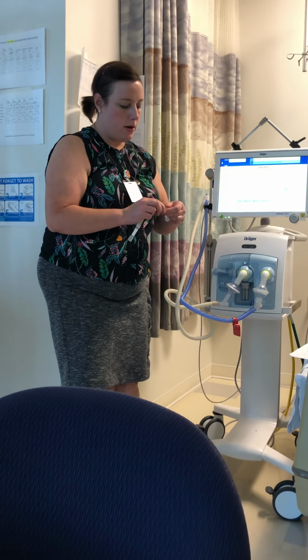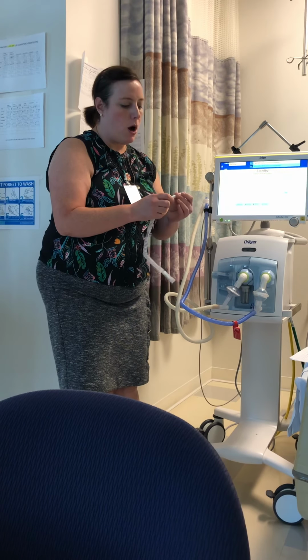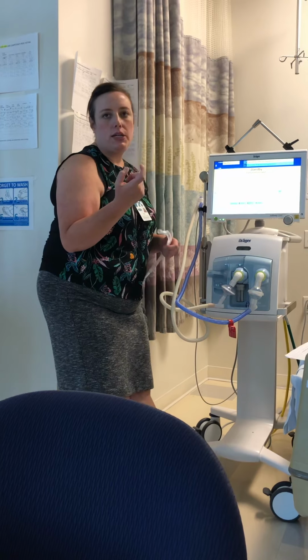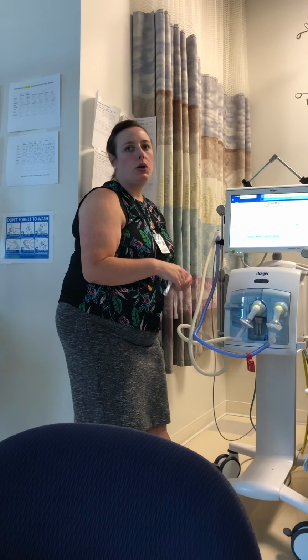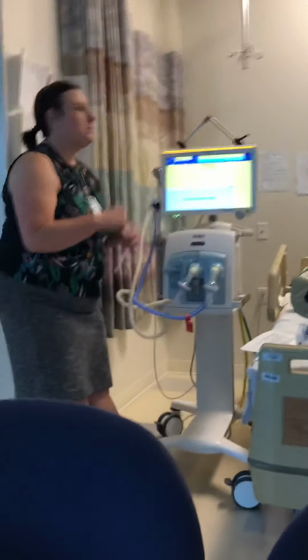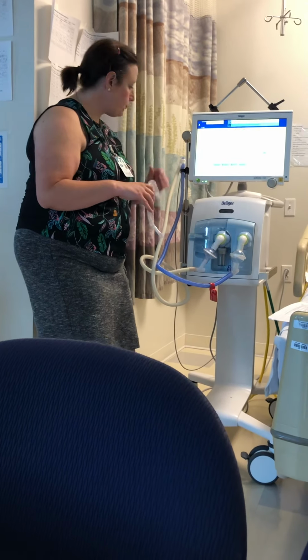So you've gathered all the supplies. We've determined that these are the correct size of prongs for this patient. There are little discs that I'm going to try to get for our class that can help you measure the actual patient's nare size, so you can choose the correct prong size before you even go to the patient bedside, instead of bringing all of the different sizes to the bedside to see which one fits.